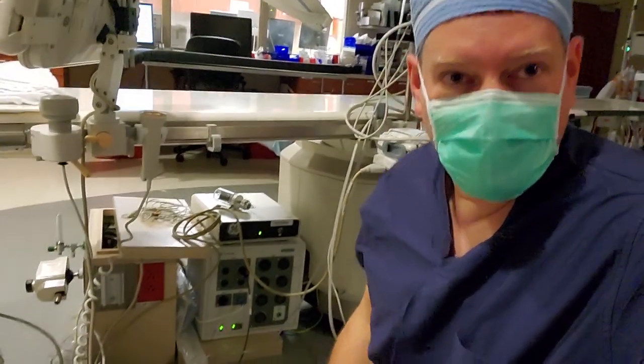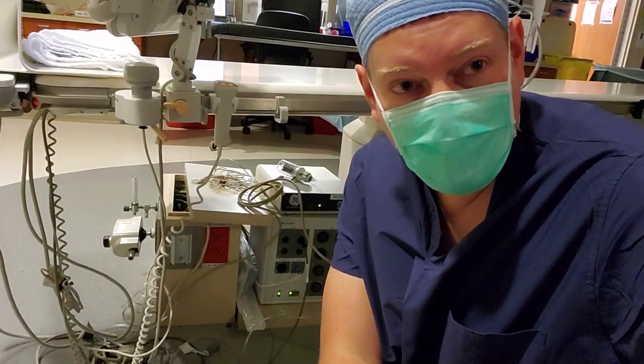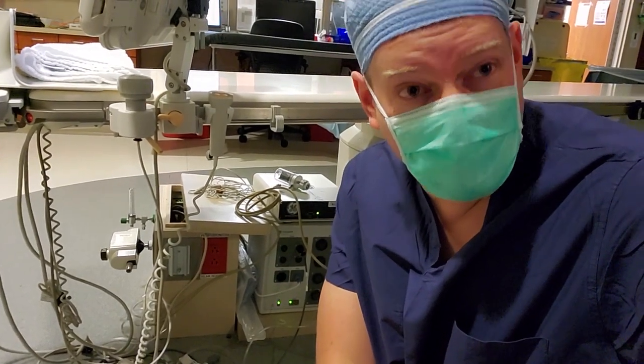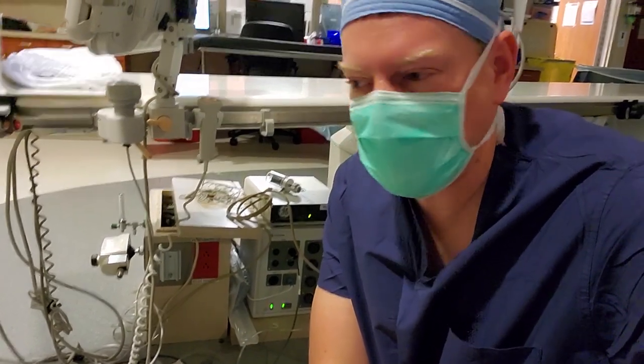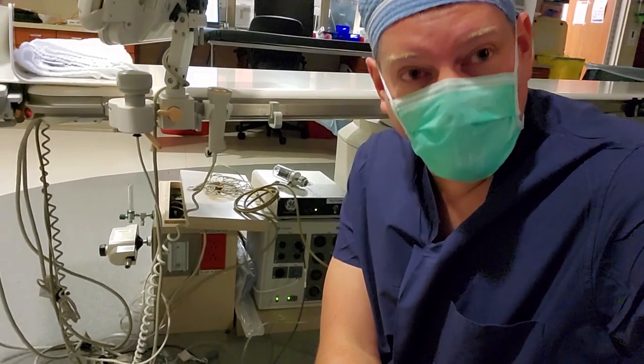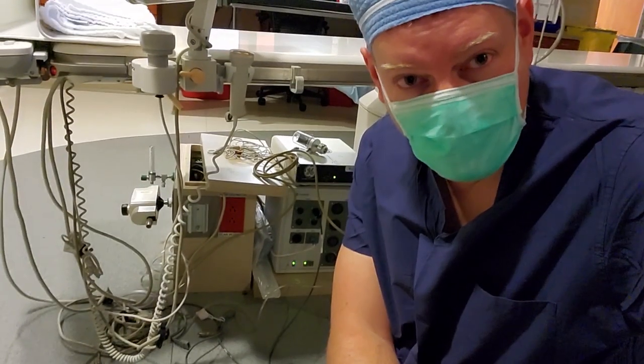The cath lab is a worst case scenario for cable management, and I'm going to show you guys a few things about cable management that are going to save you a hell of a lot of money and time, downtime specifically. So the first thing that I'm going to talk about is the basis of cable management and storage of cables.